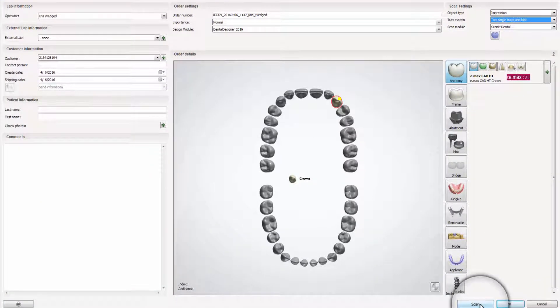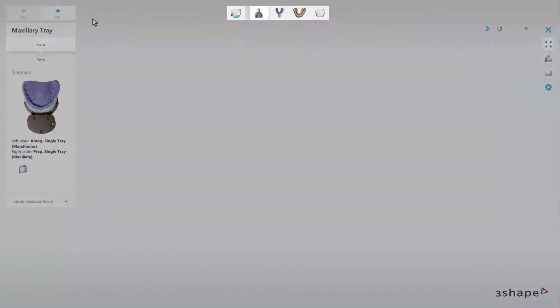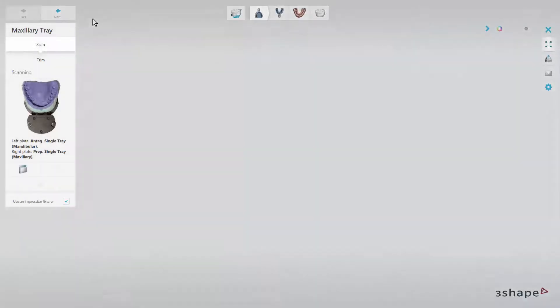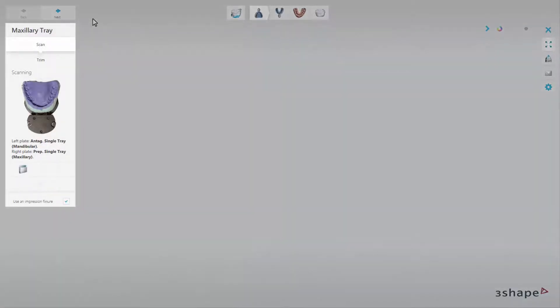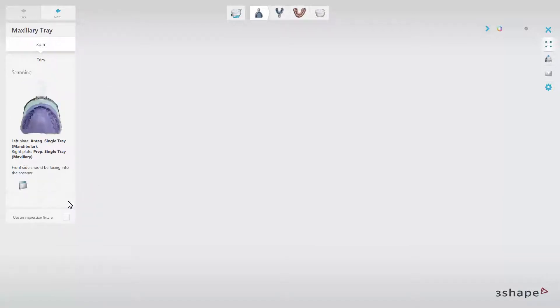Once the order is ready, click Scan. The software will automatically move you to the Scanit Dental scanning engine, where your scanning steps will be indicated on the workflow bar. The overview window will display scanning information. While scanning impressions, you have the possibility to scan with or without the use of an impression fixture — just unmark or mark the box to change between the options.